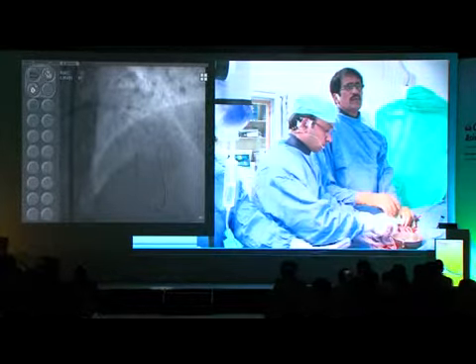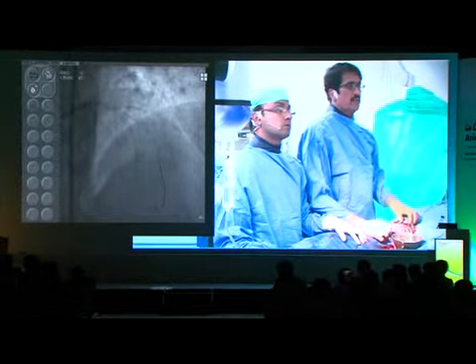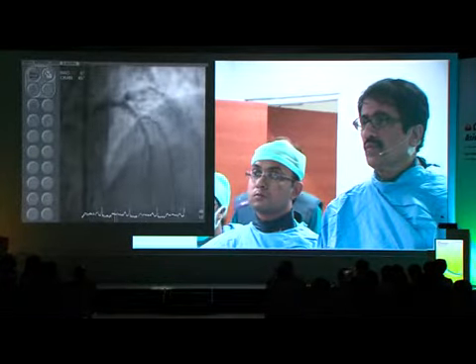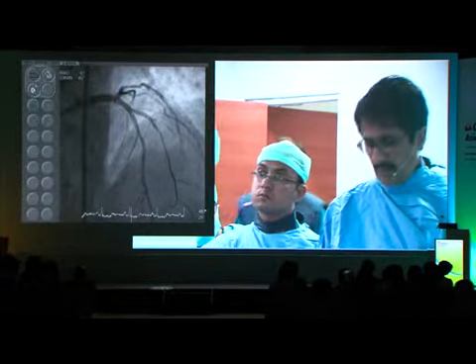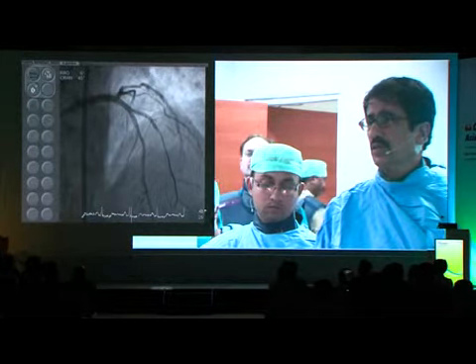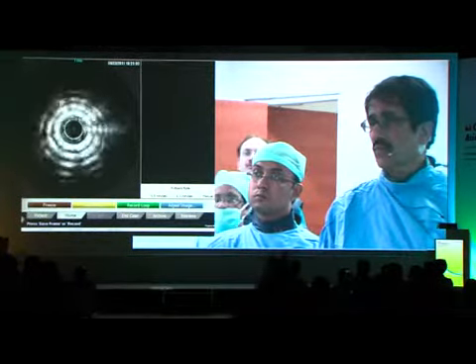On the angiogram, you look. Just show it again, the angiogram. I think it's pretty good. If you look at the proximal LAD, is that proximal optimization? Even distal to the diagonal, just after the diagonal, I think it is underexpanded. No, we have to sort it out.